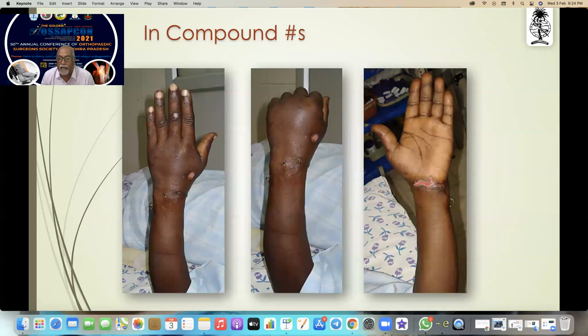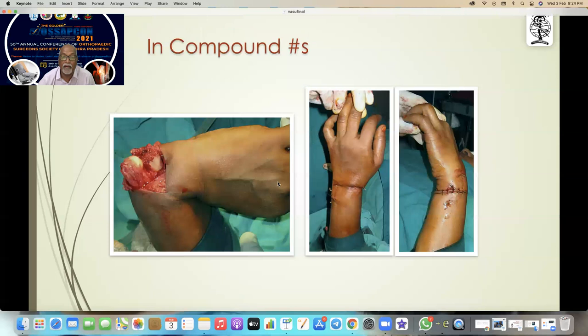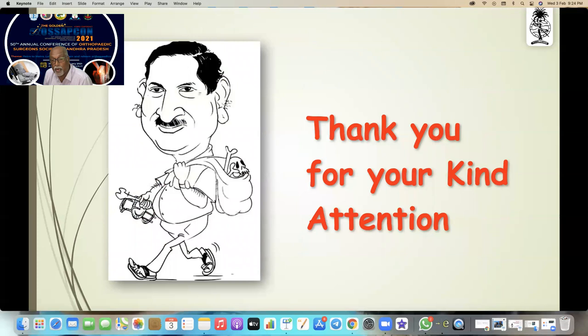You can even fix a compound fracture — you can see the compound wound there. This can be healed very well by five-pin fixation. You can see the ulnar head is reduced and fixed with the five-pin fixation. That's all — thank you for your kind attention.